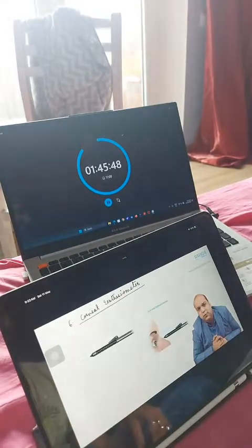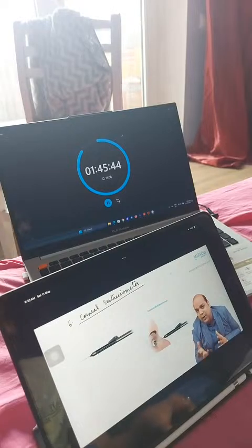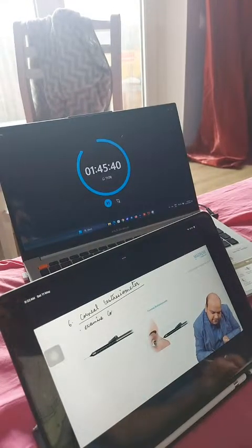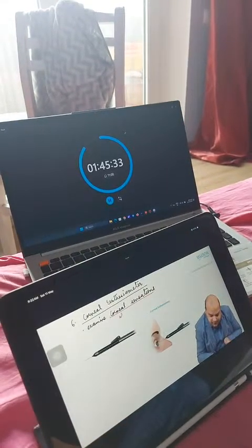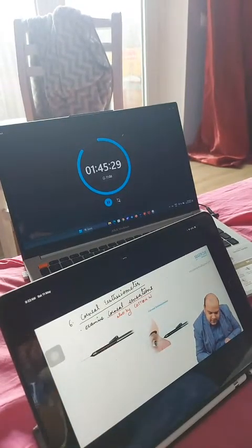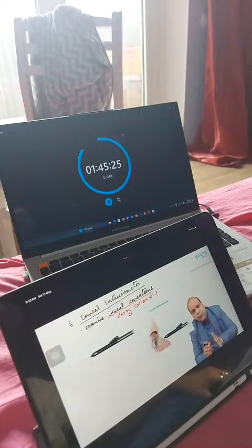The last investigation, everybody, which you have heard of, I hope, is called corneal esthesiometer. Esthesiometer, as soon as I say, you know, I'm talking about what, everybody? Corneal sensations. So it is used to examine corneal sensations. As we know, corneal sensations can also be examined by, everybody, cotton, yes or no? Cotton wisp. Again, this cotton wisp and the whole corneal sensation fundamental has been explained in the basic anatomy. I hope you have seen it. Here, I'm just talking about the investigation that is corneal esthesiometer.